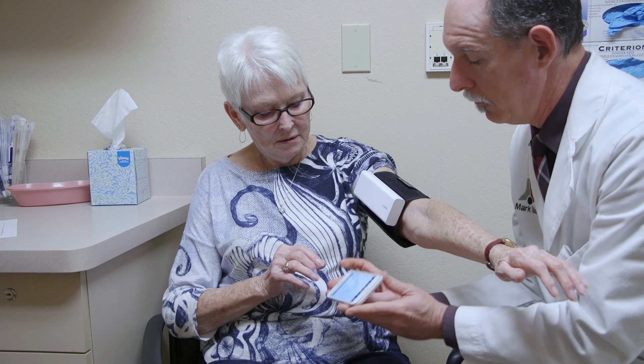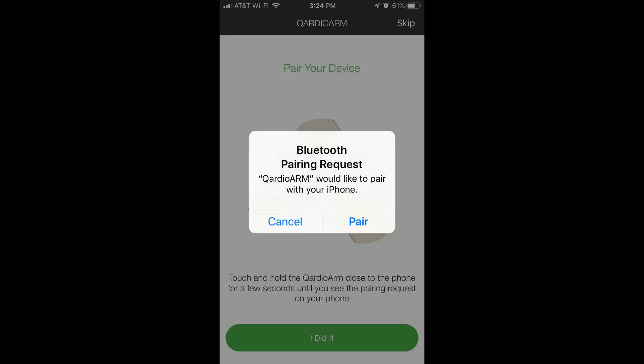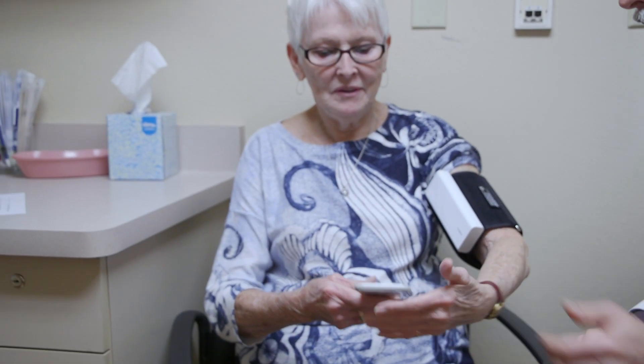A pairing request comes up. When you have your Bluetooth turned on and the Cardio unit on, it asks you to pair. Go ahead and tell it to pair.